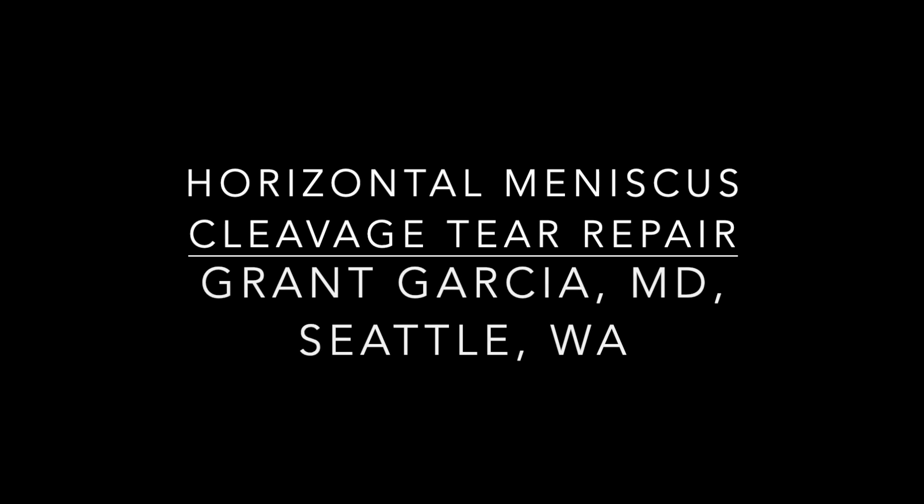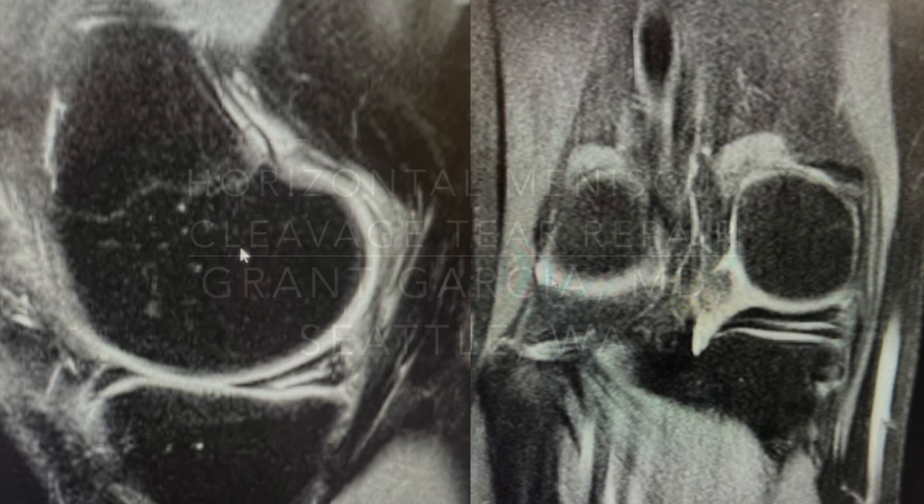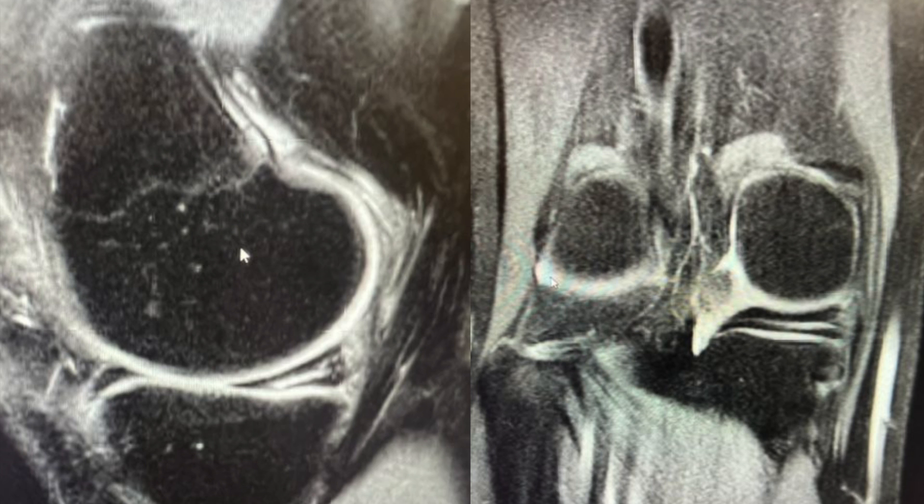Today I'm going to demonstrate a horizontal cleavage tear repair. This is a very young athlete with a significant horizontal cleavage tear, as you can see here on the MRI images.